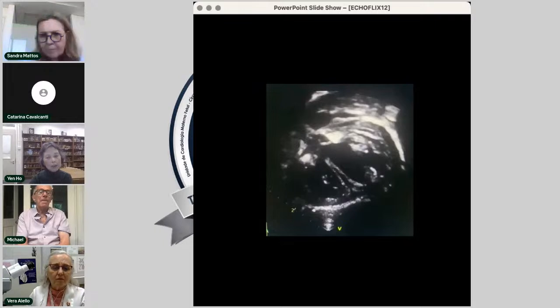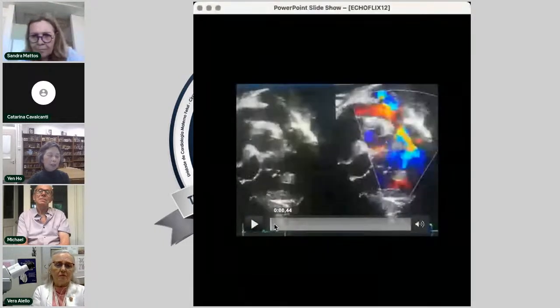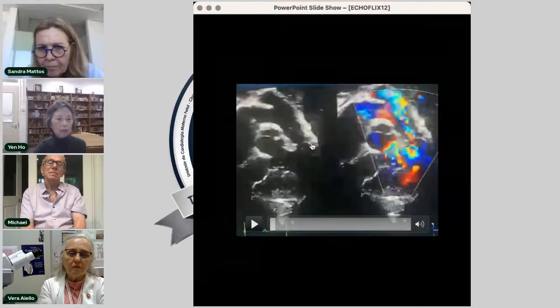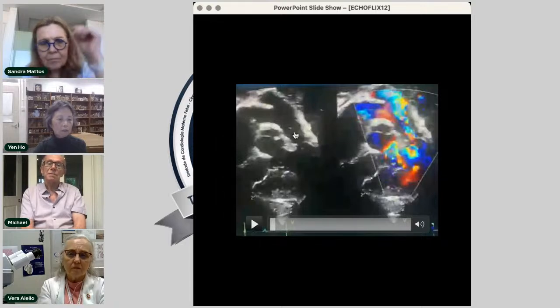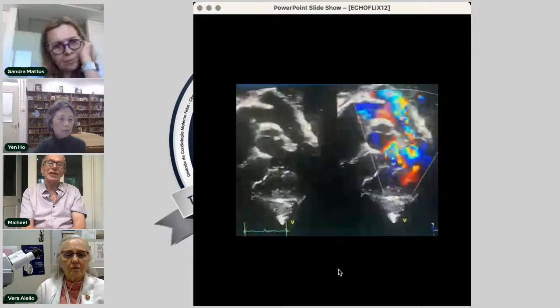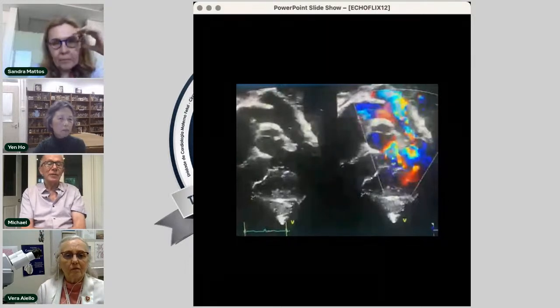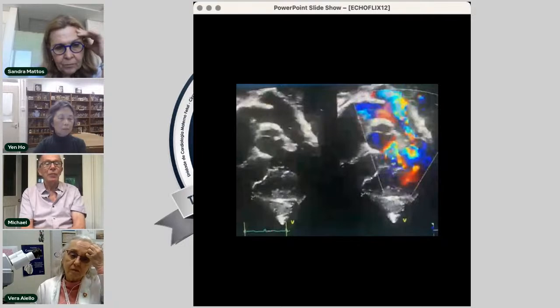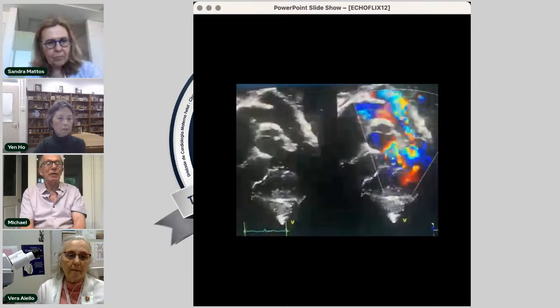I think it may be a short septum, but it's the angulation of the septum that's causing the stenosis more than anything else. And then you see the muscle bundles across the other side of the right ventricular outflow tract. Those are the septoparietal trabeculations, very hypertrophied, adding on to the obstruction. In reality, this particular case for a cardiac surgeon looks easier than the average tetralogy, because the aorta is rising from the left ventricle. They just have to close the VSD, take some of the muscle bundles out of the right ventricular outflow tract, and probably get a very good result.